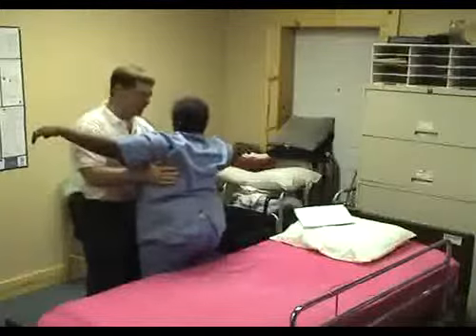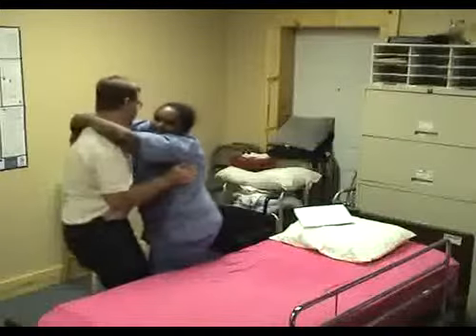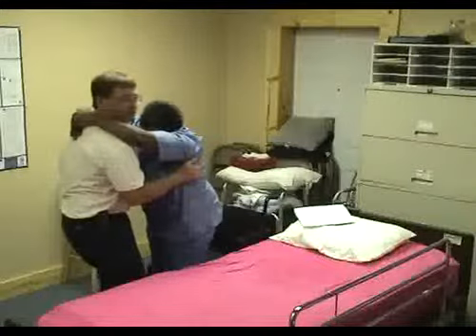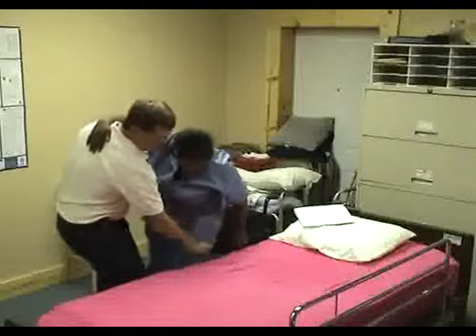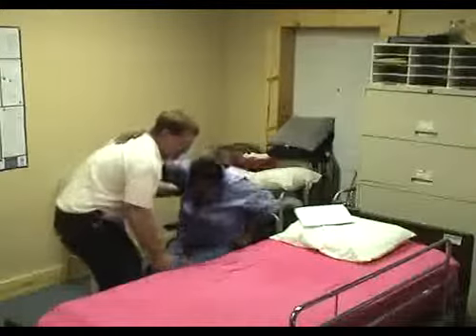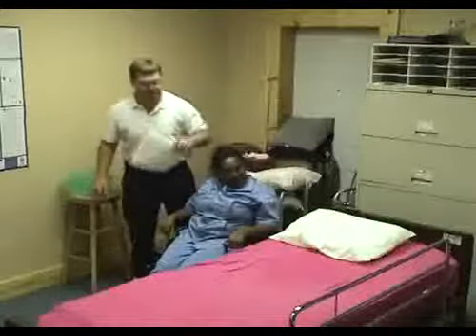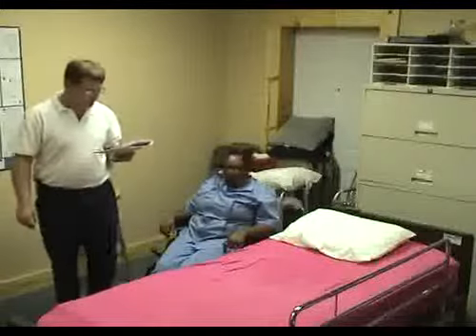Now, once we're up, we're going to turn. Go ahead and shuffle your feet. Now, if she can, you can put your left hand back on the wheelchair. Back up a little bit until you feel the chair hit behind your legs, and then have a seat. Very good. Comfortable? Okay. Get comfortable. Now, before you move again, let's see what the next step is.